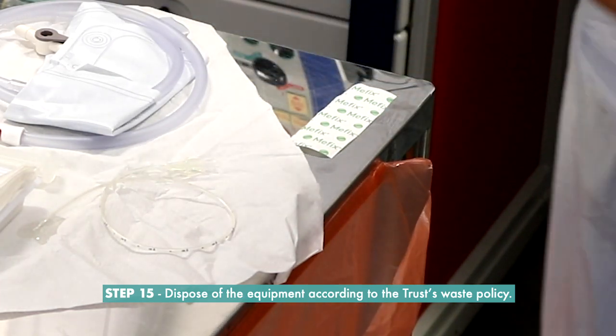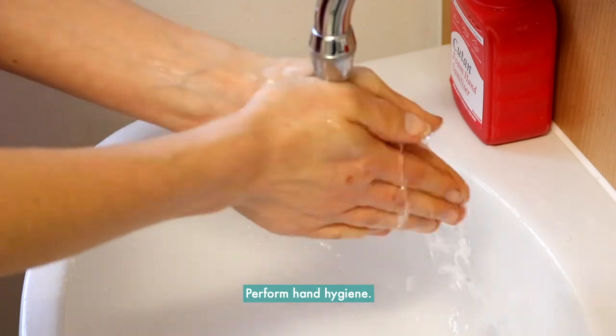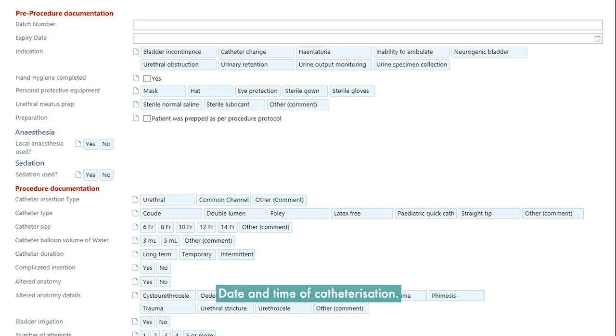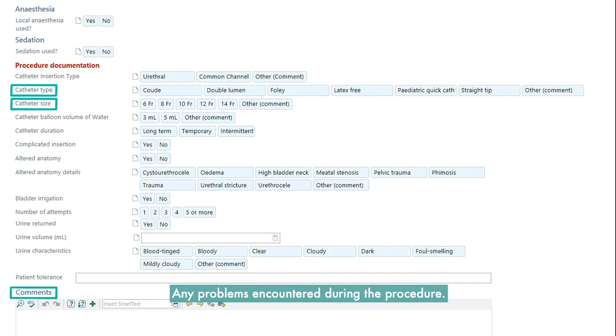Step 15: Dispose of the equipment according to the trust waste policy and perform hand hygiene. Step 16: Following catheterization, the following must be recorded on EPIC: date and time of catheterization, batch number, reasons for catheterization, type of catheter including length and size, any problems encountered during the procedure, and review date and date to change the catheter.